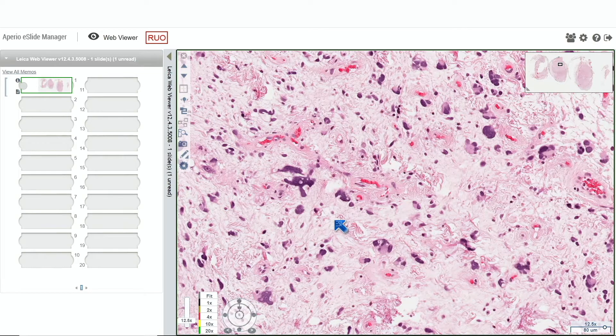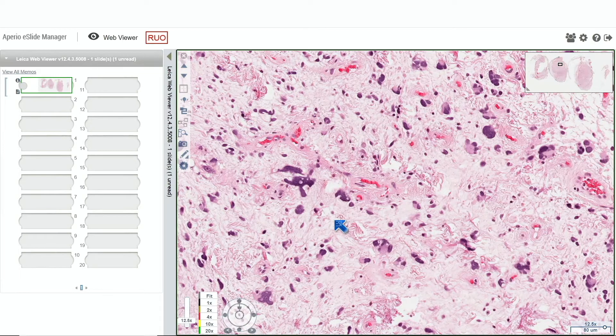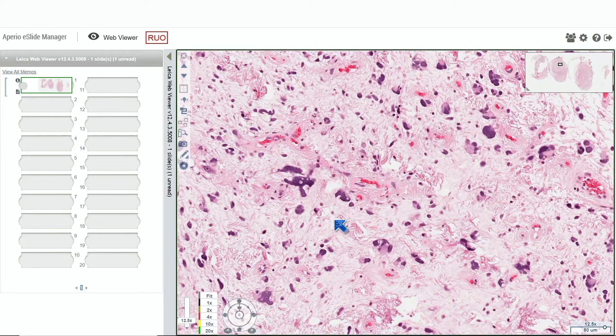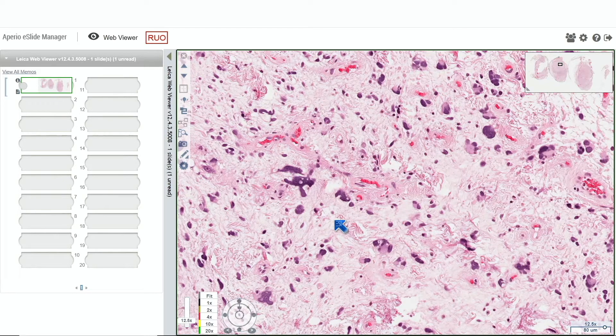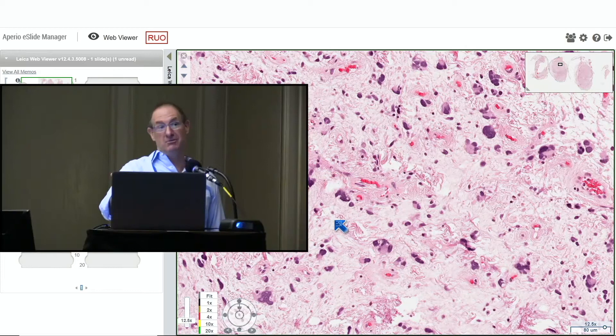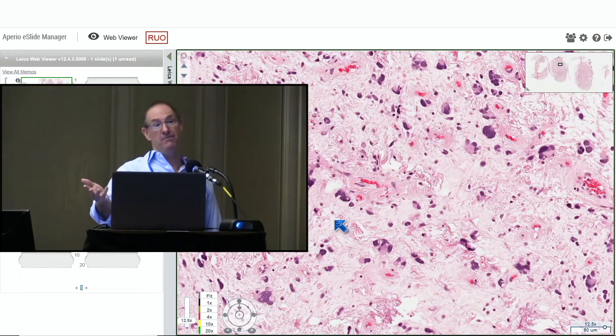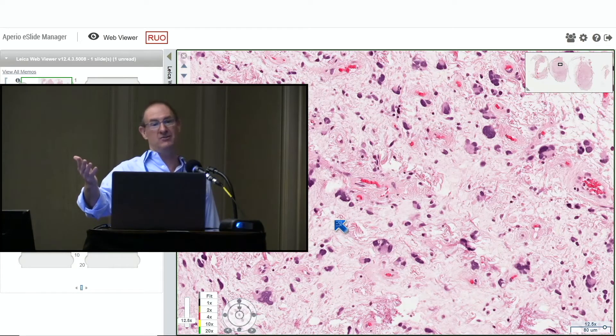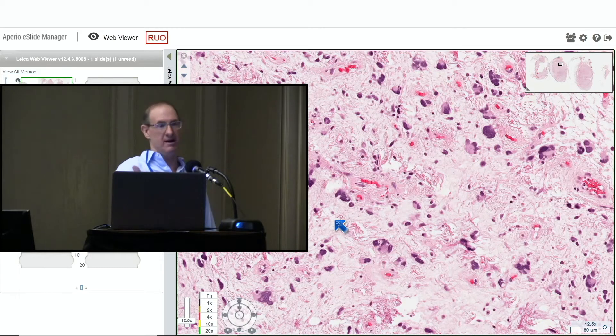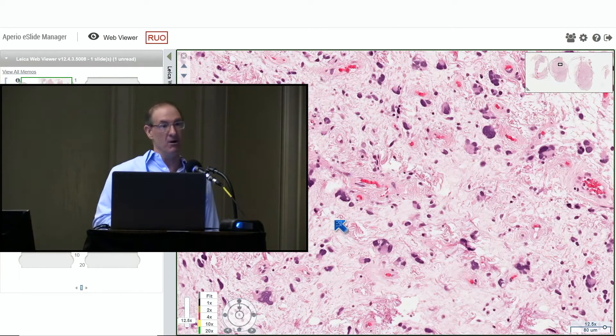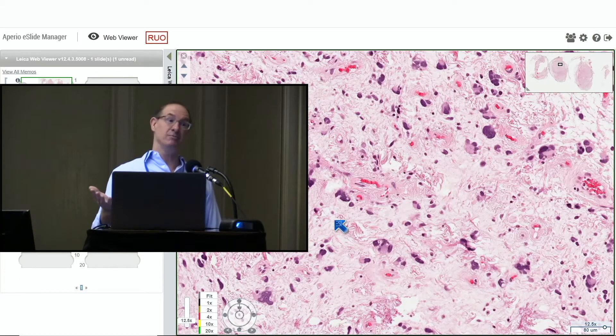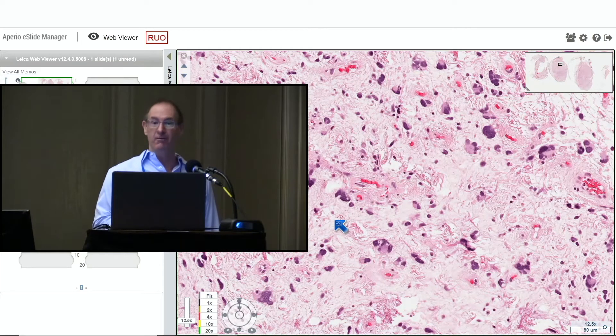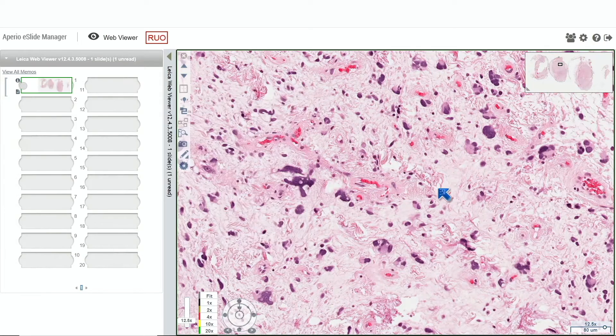Actually, a CD34 in that circumstance might be helpful because UPS should not stain for CD34 to any significant degree, whereas this will light up like a Christmas tree for CD34. So in that circumstance, I could argue CD34 might be helpful because this thing would be completely brown.